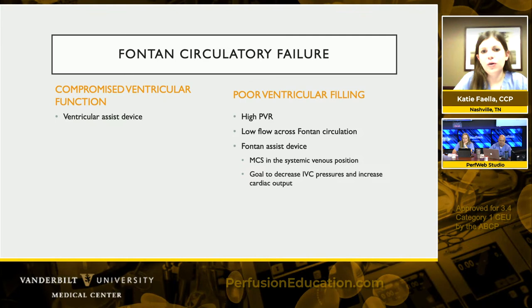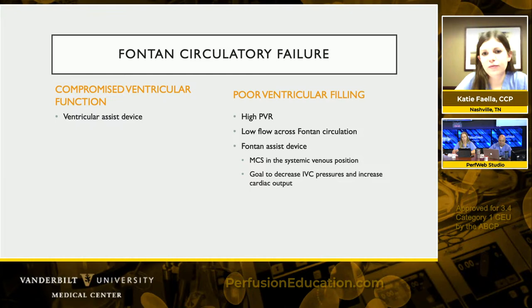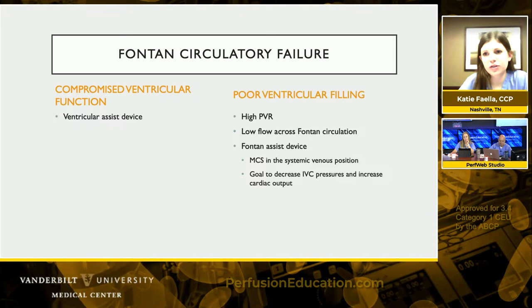So if you have poor ventricular filling, a high PVR, and low flow across that Fontan circulation, then you might be a candidate for this theoretical Fontan assist device. That's using your CentriMag or PediMag in the systemic venous position and trying to increase flow across that Fontan circulation. So the goal is to decrease your IVC pressure and increase cardiac output.